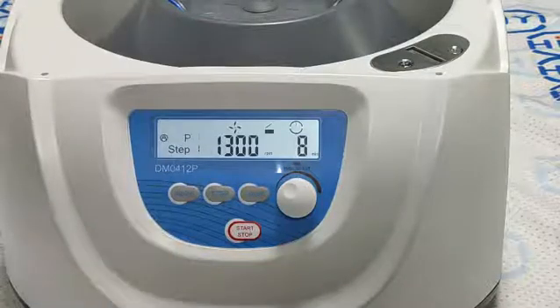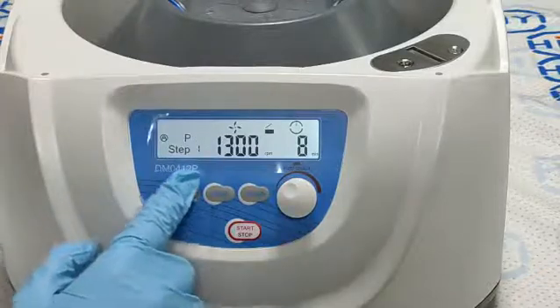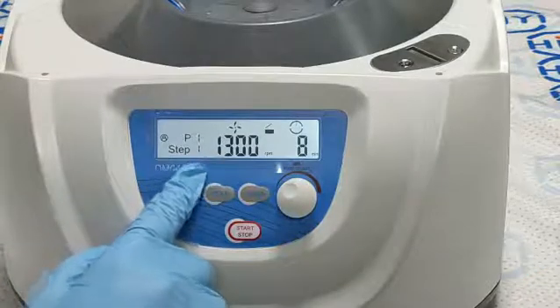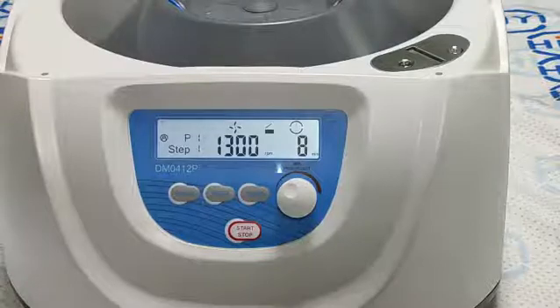Then we press the PROG button and it's a customized program. We press the PROG button to choose a program. There are 9 programs available and 6 steps for each program.